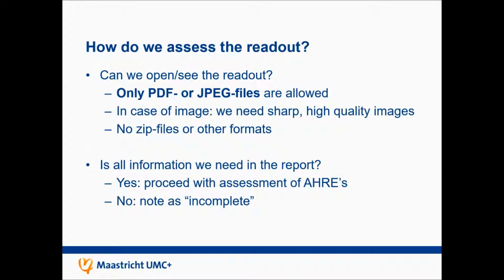Sometimes we have to do measurements on the EGMs. When we get zip files or other file formats, we just can't open them. So then you'll get a comment back to please re-upload in another file format. When we can open the file, I'll check if all the information we need to assess the report is in the file. If it is, we proceed with the assessment, and if it's not, then we stop there and we mark it as incomplete, and you'll also get it back with a comment.